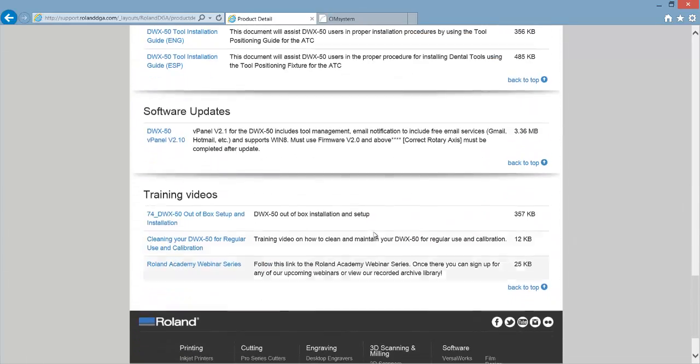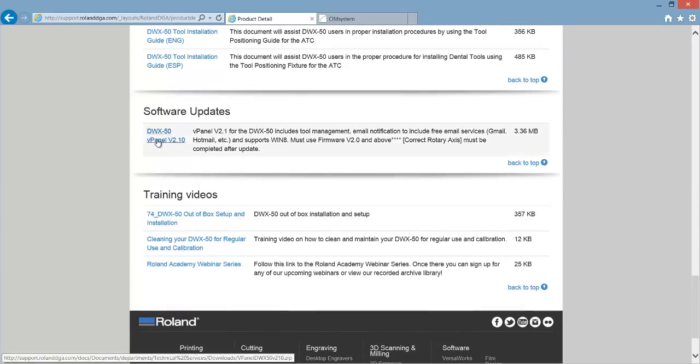And under software updates is the final update for the DWX50, which is the DWX50 vPanel update. Click that link and save it as well.